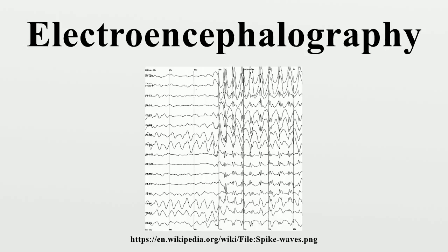EEG is commonly recorded at sampling rates between 250 and 2000 Hz in clinical and research settings, but modern EEG data collection systems are capable of recording at sampling rates above 20,000 Hz if desired. MEG and EROS are the only other non-invasive cognitive neuroscience techniques that acquire data at this level of temporal resolution. EEG is relatively tolerant of subject movement, unlike most other neuroimaging techniques. There even exist methods for minimizing, and even eliminating, movement artifacts in EEG data.